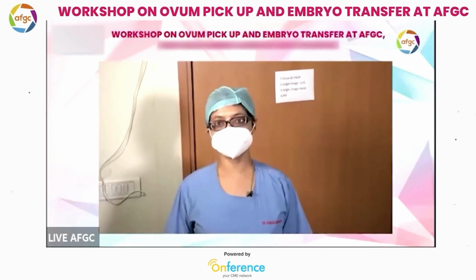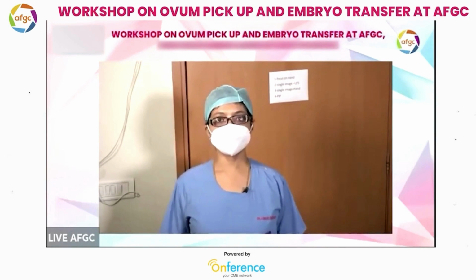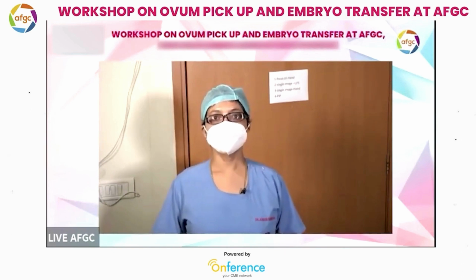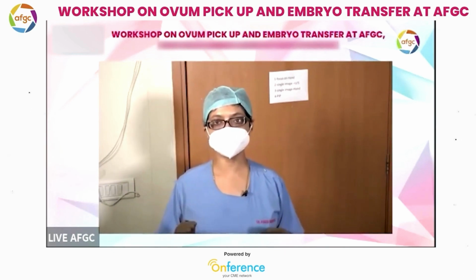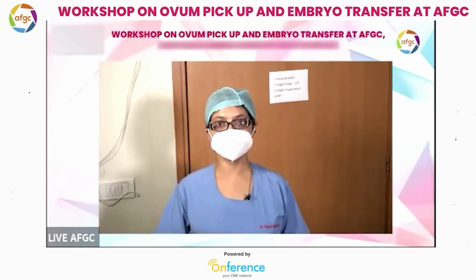Start the live demonstration of the 2D ultrasound, transvaginal. Now before we start to do the transvaginal process, we must know about the history very carefully. Most important, the last menstrual period.